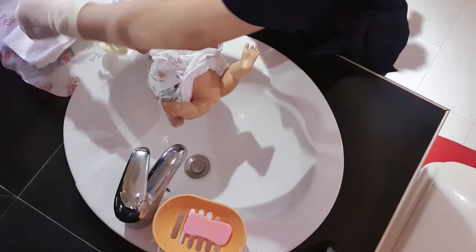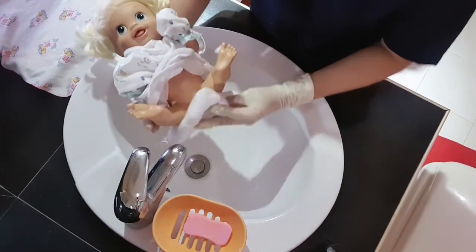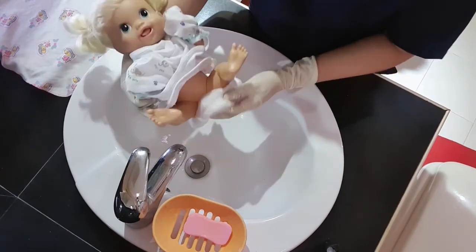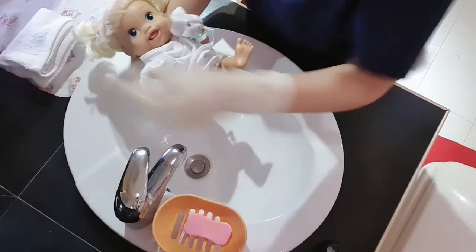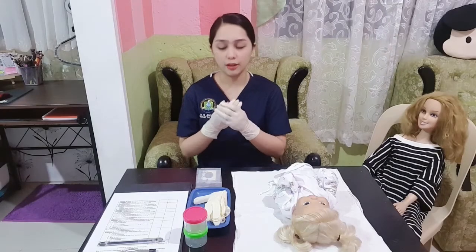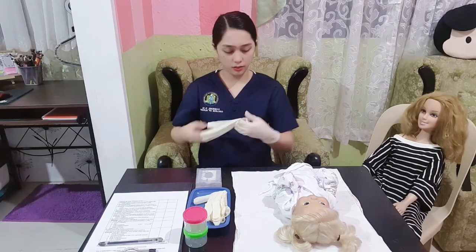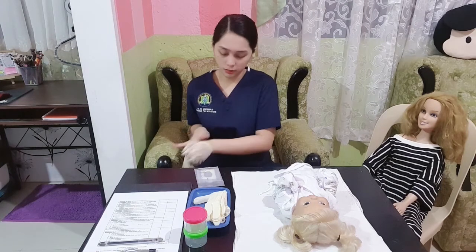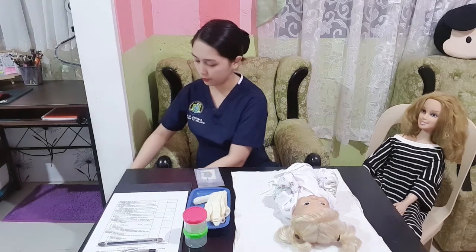Then, dry the perineal area thoroughly. This is to ensure that the urine collector will stay in place. Now I will be changing my gloves. I will remove and discard my gloves, and will be performing hand hygiene. This reduces transmission of microorganisms.